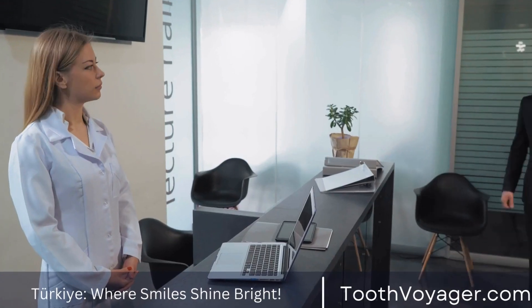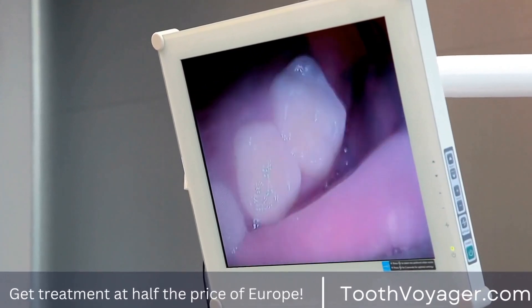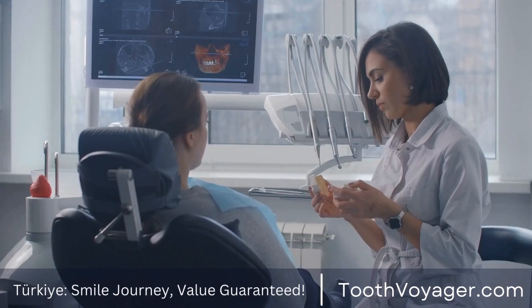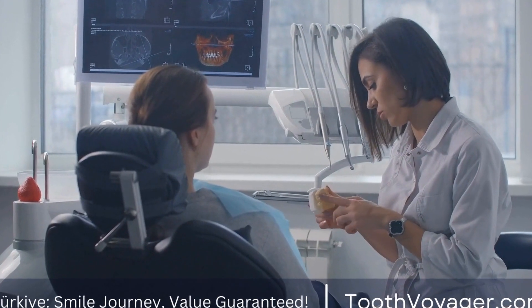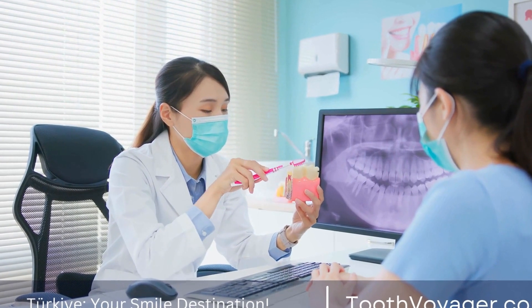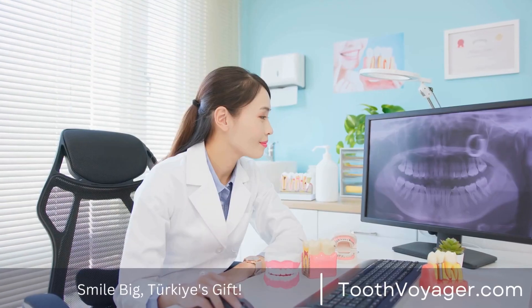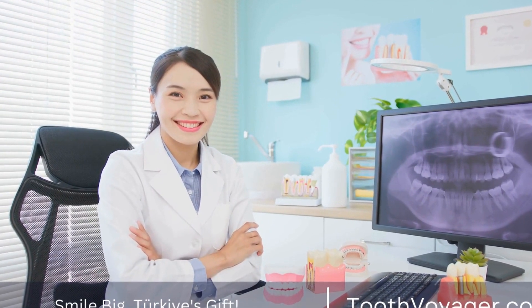Step 3 – Osseointegration. Osseointegration is a crucial step in the implant dentistry process. It typically takes several months for the implant to fully integrate with the surrounding bone. During this time, the bone cells will grow and attach to the implant surface, creating a strong bond. It is important to follow your dentist's instructions during the osseointegration period to ensure successful integration.